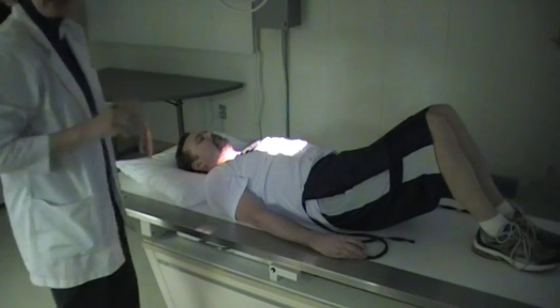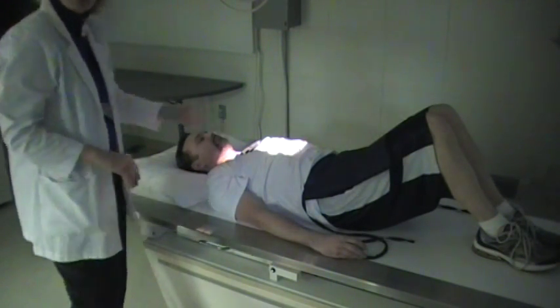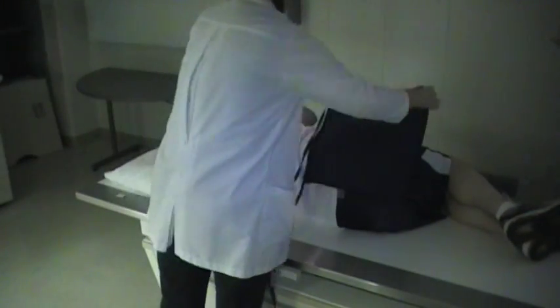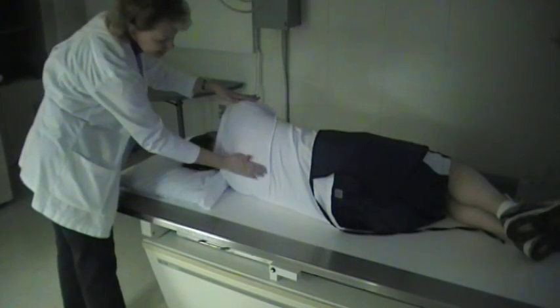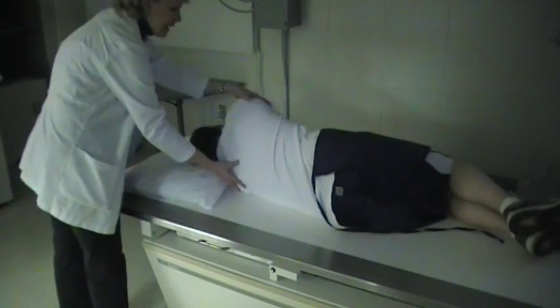Place your right marker on the film, but be sure to move it in from the edge so that it will be seen on the image. Now when we do the lateral T-spine, have the patient turn onto their left side. Have them put their head down, and bring their arms up at about a 90-degree angle with the elbows bent. You want to make sure that the back is nice and straight — directly perpendicular to the table. If the patient is leaning forward, the back is not straight, and you have to correct that.